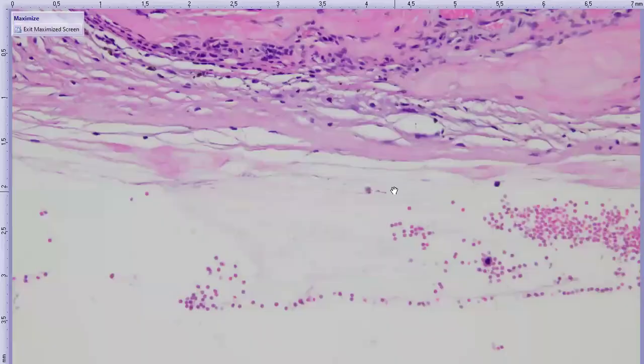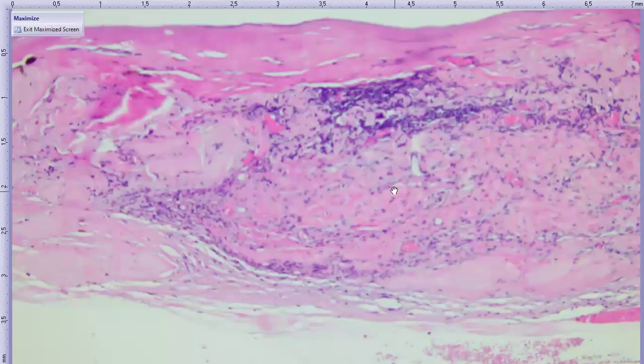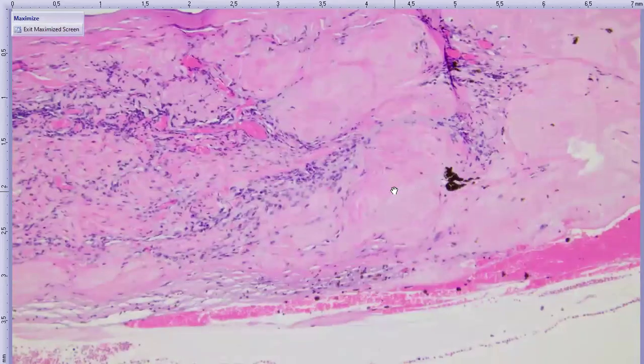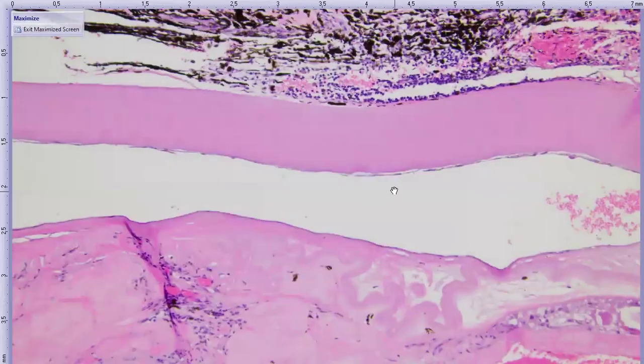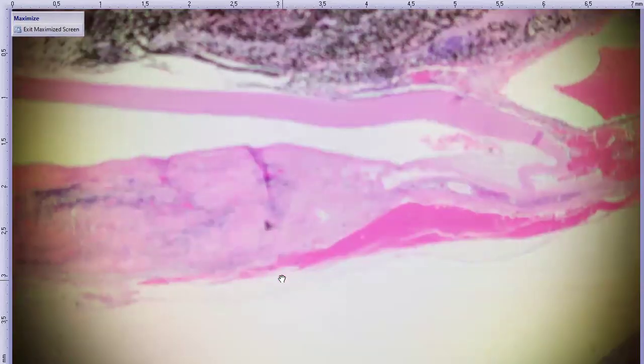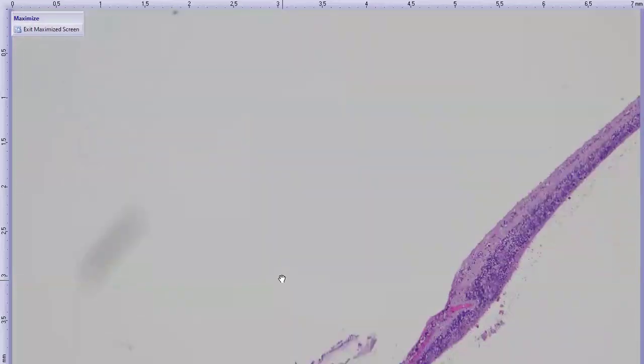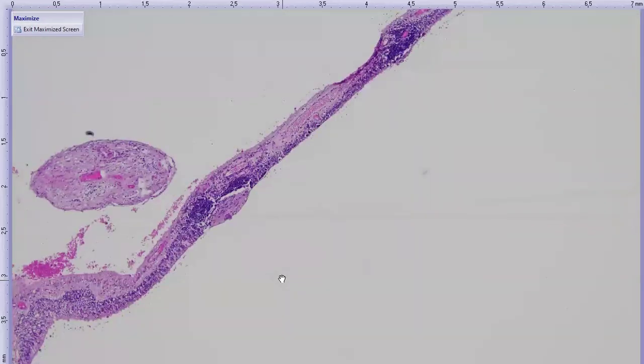Anyway, so this collagenous plaque is like one of the nicest hallmark features of persistent fetal vasculature in the eye. And there's often a cataract that goes with it. We have very few lens fibers remaining in this eye. You can see there's more of that posterior lens capsule that's quite convoluted and wrinkled. And then the retina. The retina is frequently detached in these cases, as it is in this case.